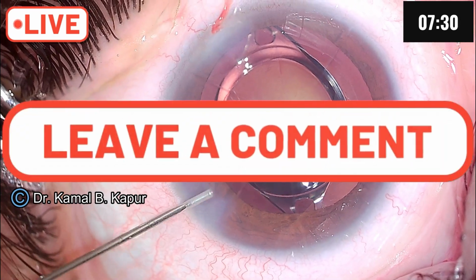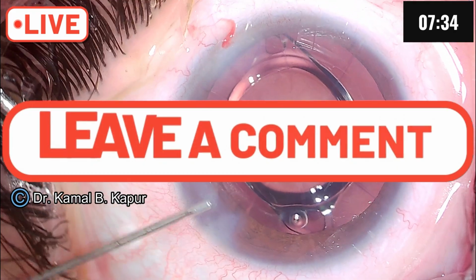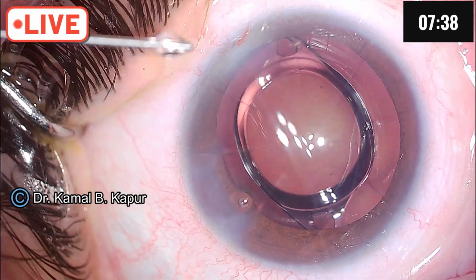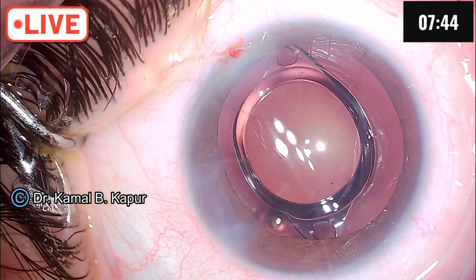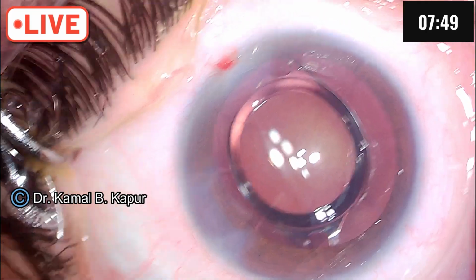And always a good idea to hydrate the roof of the wound rather than the sides in a post-RK case, because you can cause an unnecessary hydration of the incision and cause extension of the incision. And there you are. Beautifully centered lens, absolutely perfect surgery.